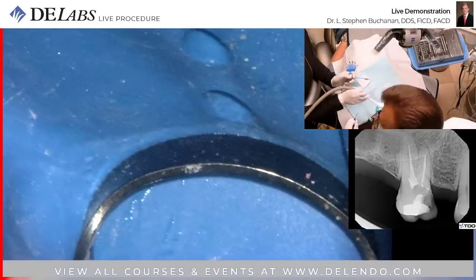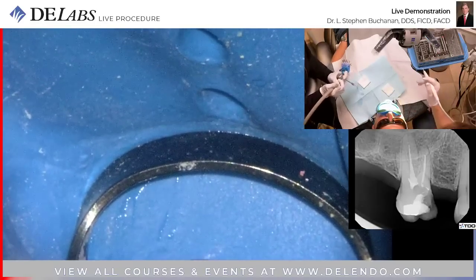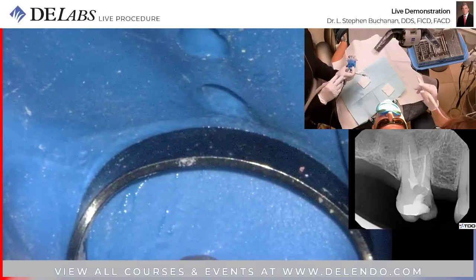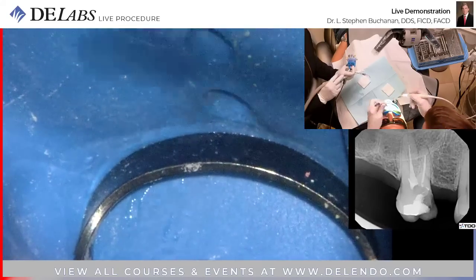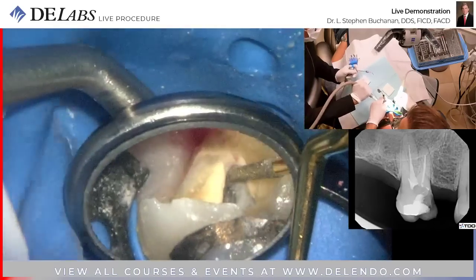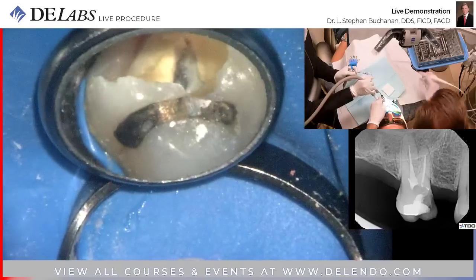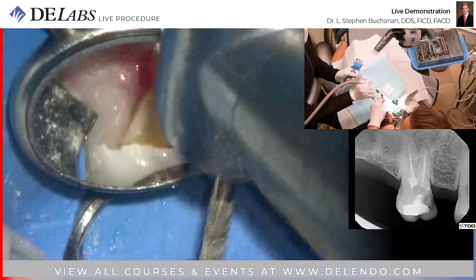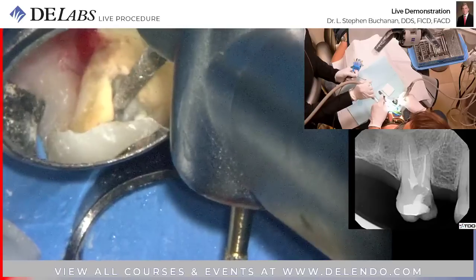Okay, so the question I get often is, can you perforate with ultrasonics? And the answer is, yeah, it just takes a long time. So what are the advantages of ultrasonics? One, you can see perfectly. You can see exactly where this is going to cut. As it's cutting, here's the counter view. You can get a side view, not that easy.